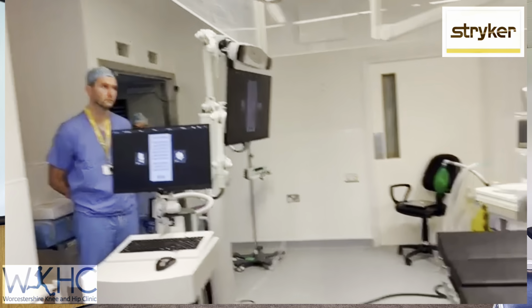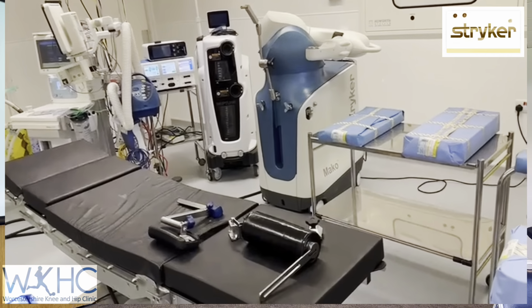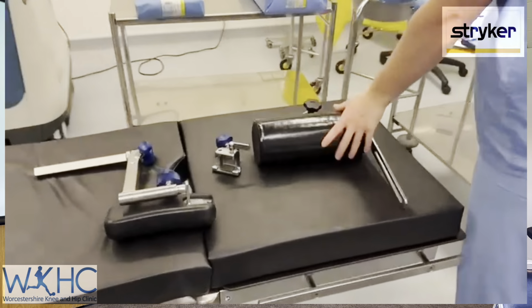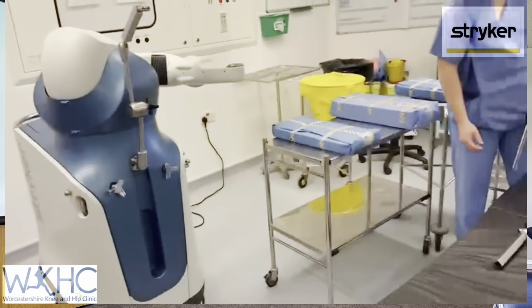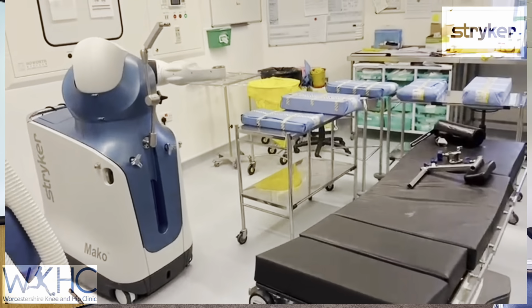From the knee replacement point of view, the robot comes in on the side of the actual knee. So the patient's positioned on the table, and the robot will come in on the same side. And you can see the sets there. They're all laid out.